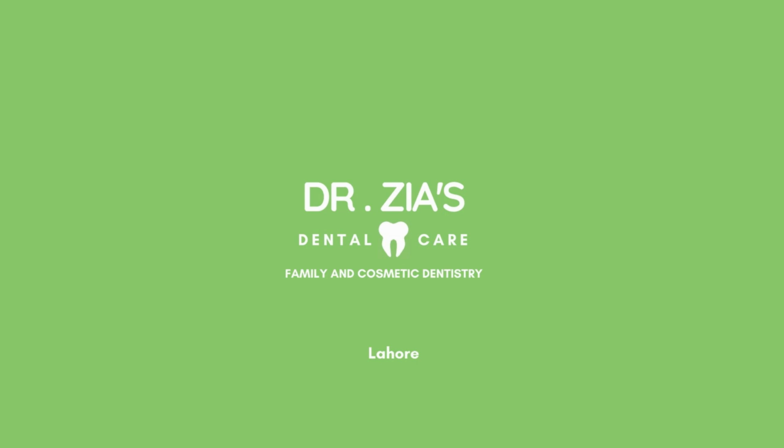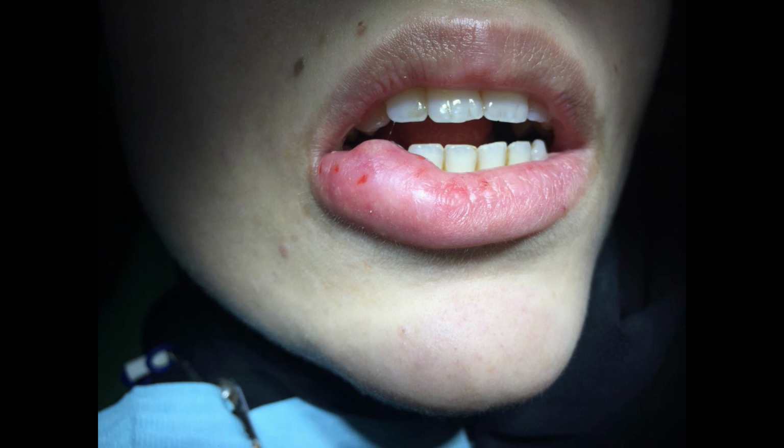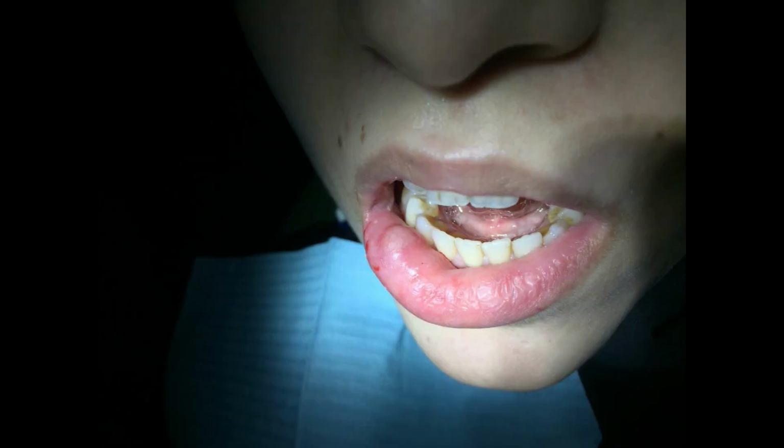We have a case of mucocele in a female patient that appeared in the lower lip, on the right side of the lower lip. As we can see, it was interfering with the speech of the patient and with the masticatory functions, and it was exactly coinciding with the canine of the right side, upper and lower both.